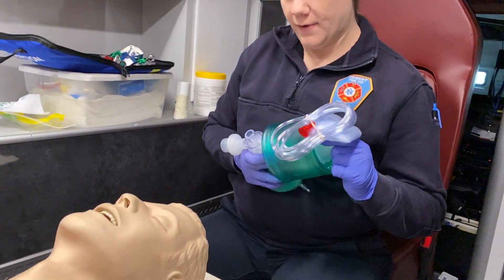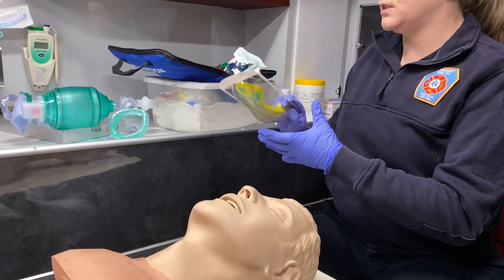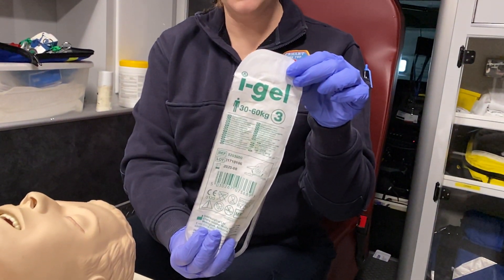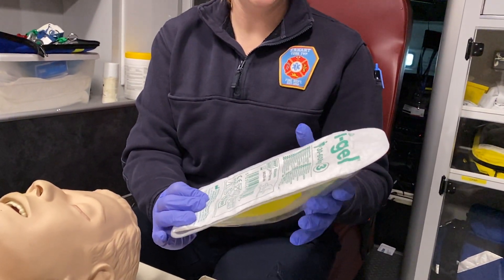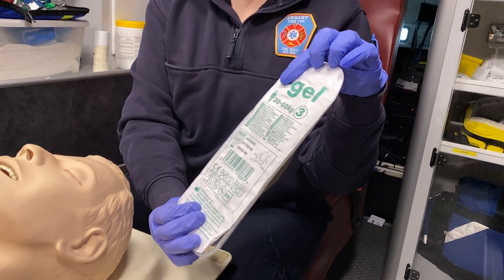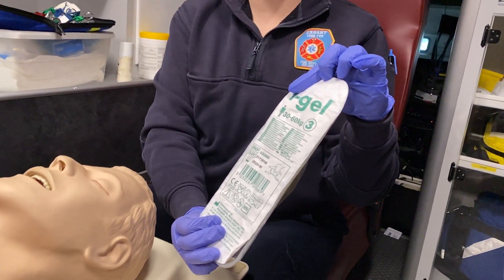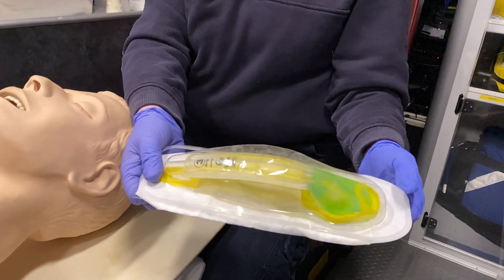We're going to go over our supraglottic airway devices. The first device we'll use is the i-gel, which is replacing the LMA. It's shaped a lot like an LMA and works the same way. You pick your size based on weight — typically a size 3 for a normal-size adult and a size 4 for larger adults. The 3s come in yellow packaging and the 4s in green.